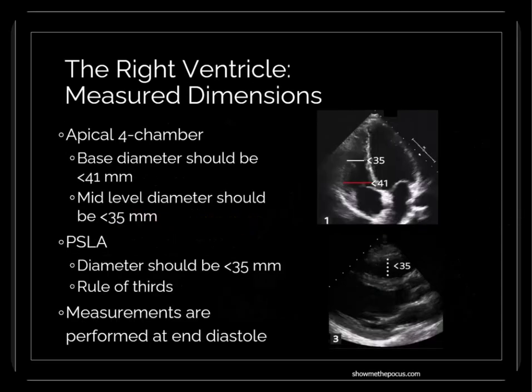You can also measure the right ventricle. This is not something I do frequently, but if you were to measure the right ventricle, you want to measure the base diameter and mid-level diameter.